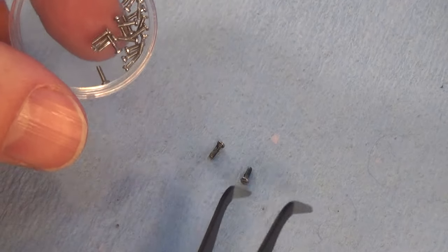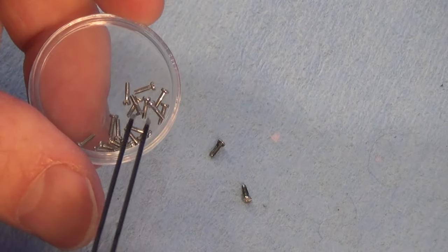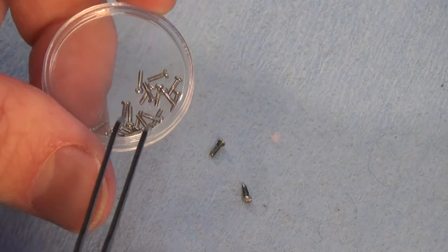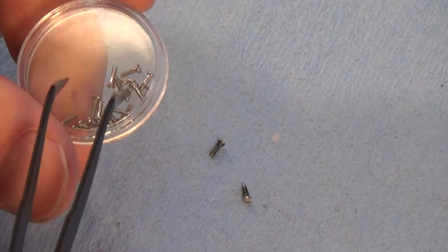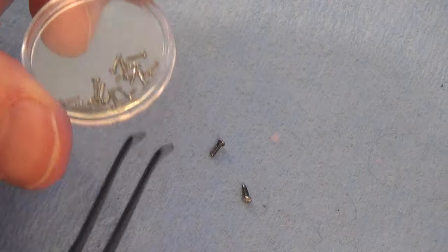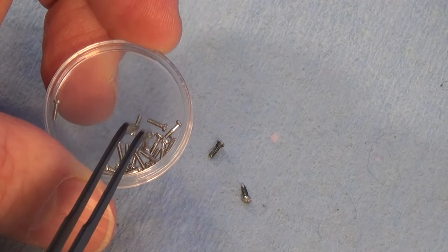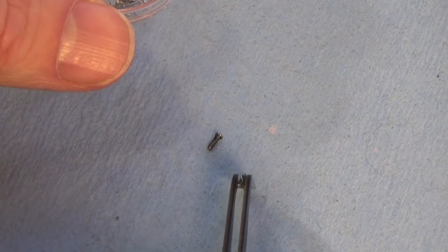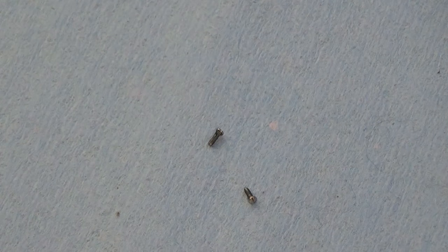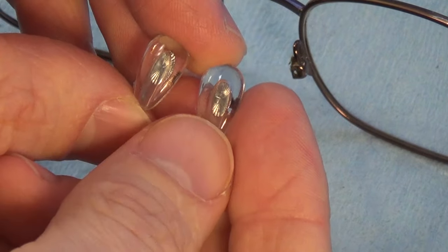Next, decide whether to use the original screws or the replacement screws from the kit. In my case I still have both original screws. The replacement screws look a little longer and possibly thinner, and in this kit they all appear to be uniform size rather than a variety. Since I have the originals, I'll reuse those and save the replacements for another time.